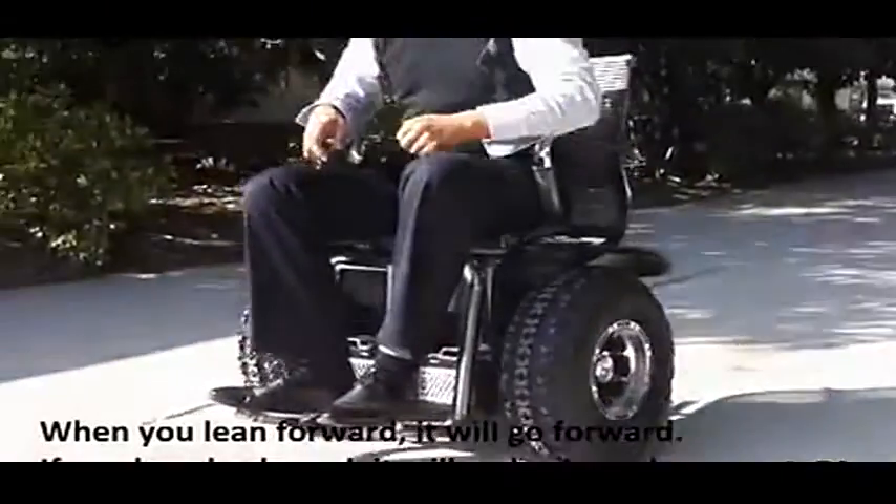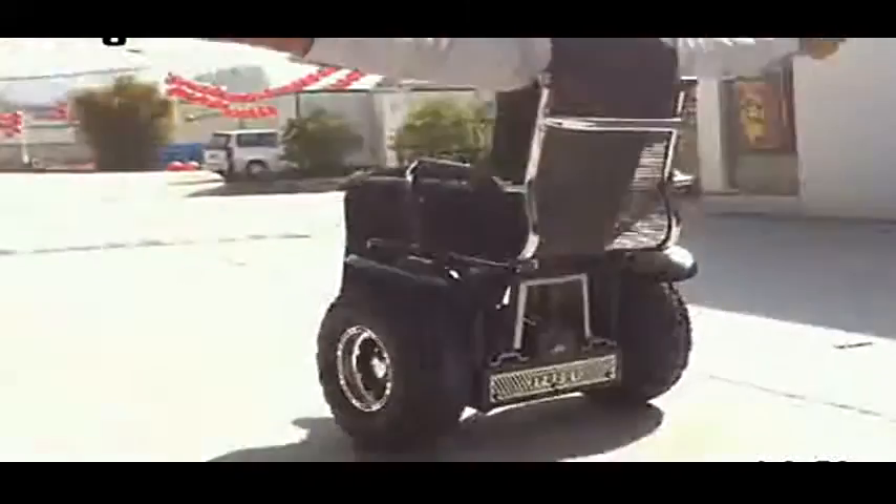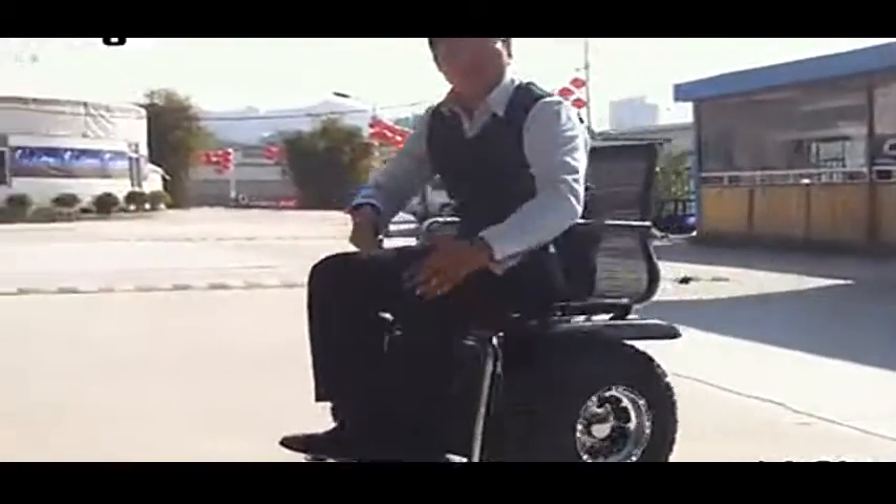If I want to go forward, my body can go like this. Go. And I stop and do like this. It can be very nice. It can be very good.